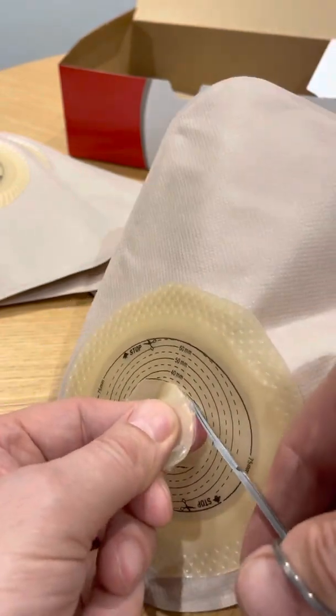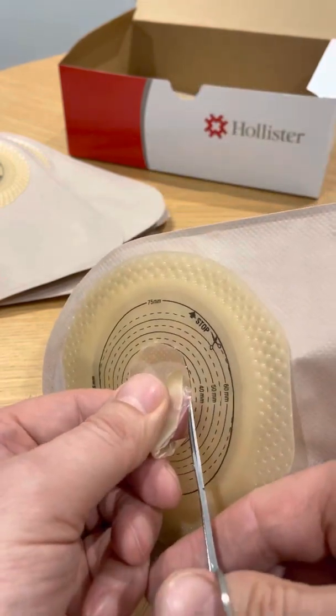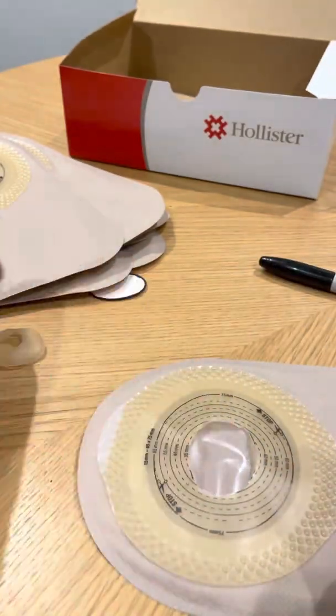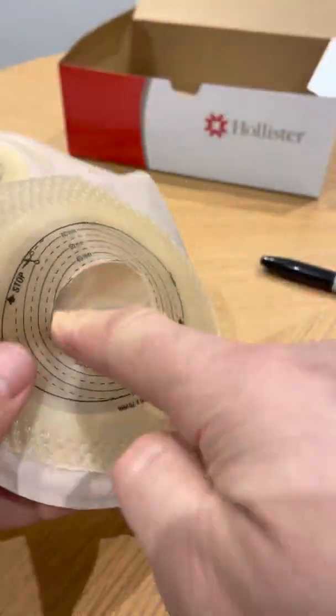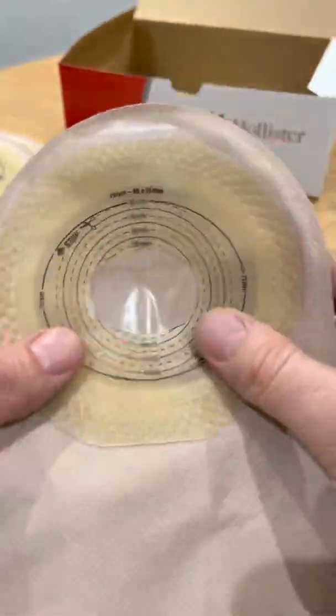Obviously I'm taking longer doing this on camera than I would when I'm actually in the zone, as it were. Then you discard that bit and you're left with a beautiful, perfectly cut out shape. And if you have a look inside, there's absolutely no tear to the inner plastic, no punctures, and there you have it.